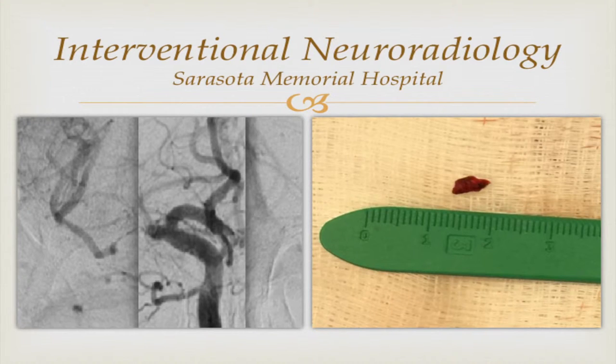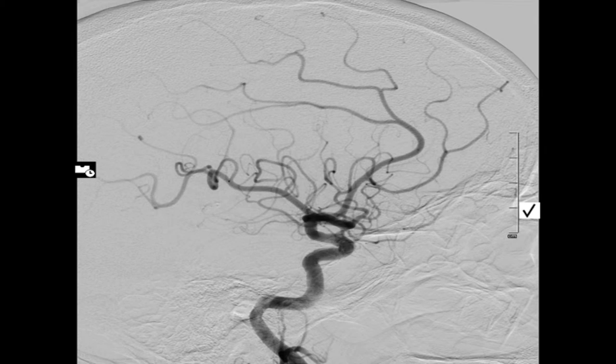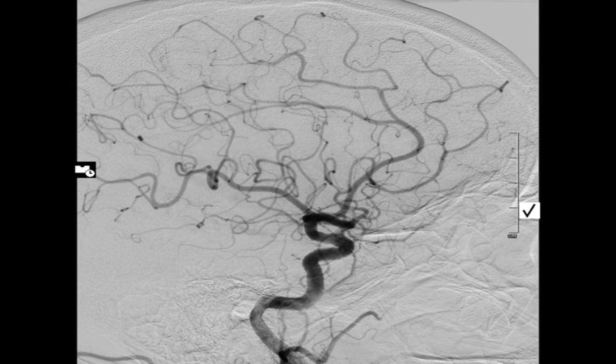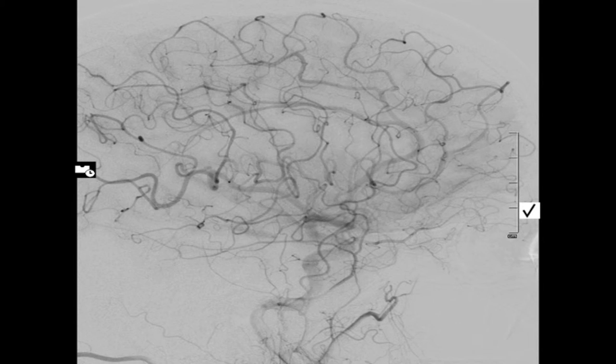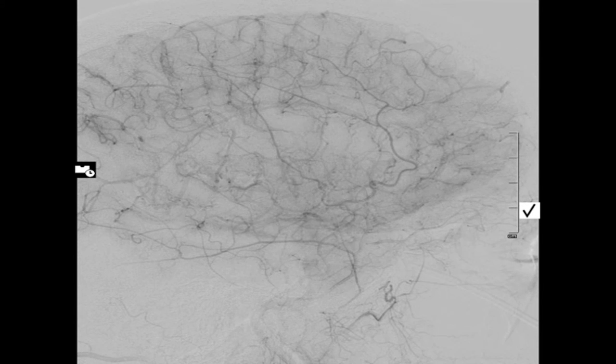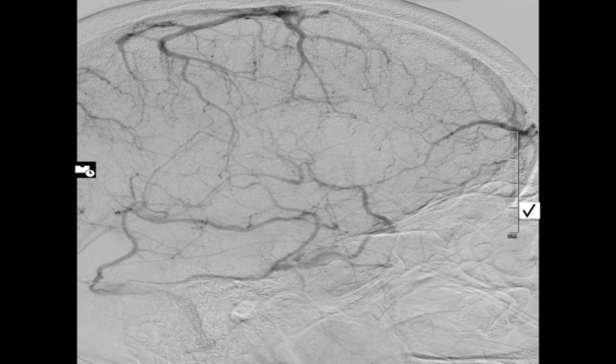So after I did a thrombectomy, came up to here, grabbed that clot, and pulled it out. There it is right there. There's normal. See that MCA was there? I don't know if you guys caught it. I put it at normal speed. The other ones were at fast speed. So there's that MCA distribution right there that's now going back to normal flow.